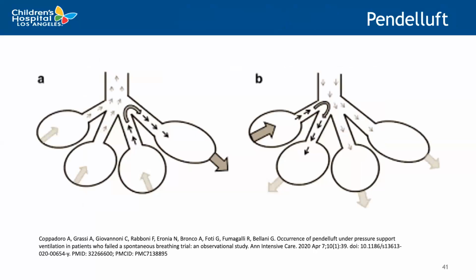So what about this notion of pendelluft? Pendelluft is a concept that, again, ARDS is a heterogeneous process. So pendelluft is kind of a representation of that. Different alveoli may have different time constants.